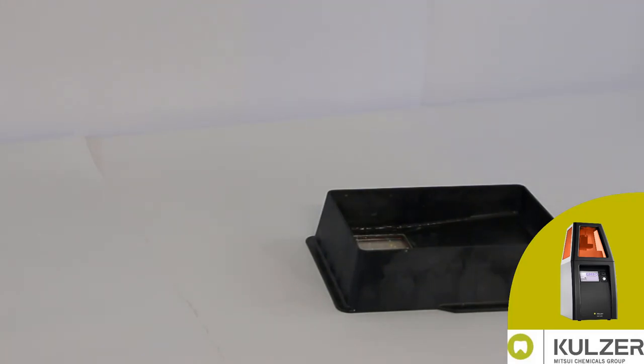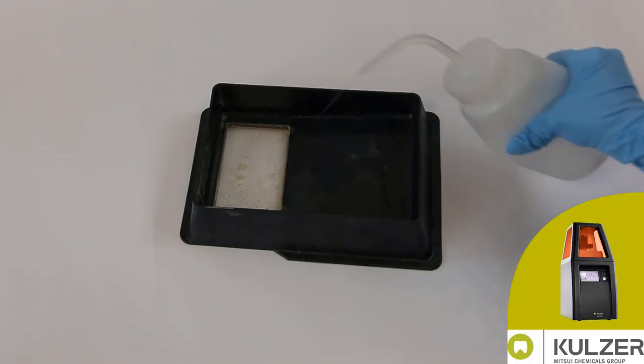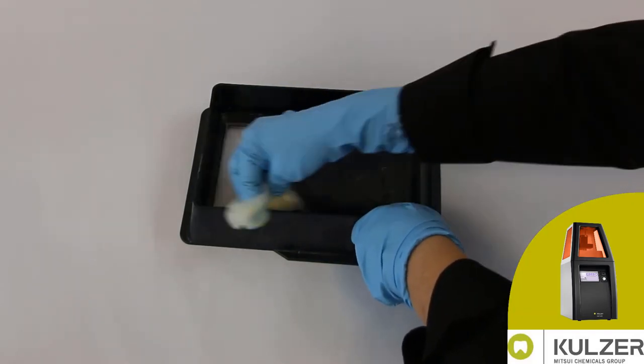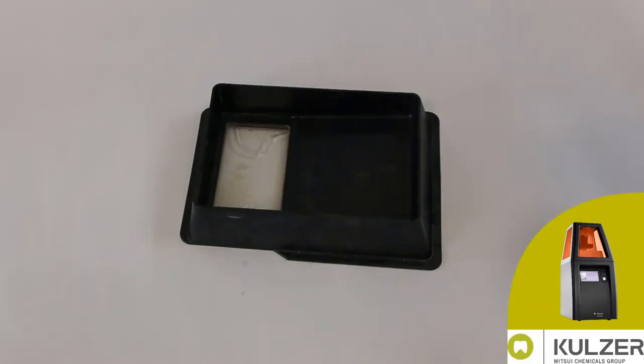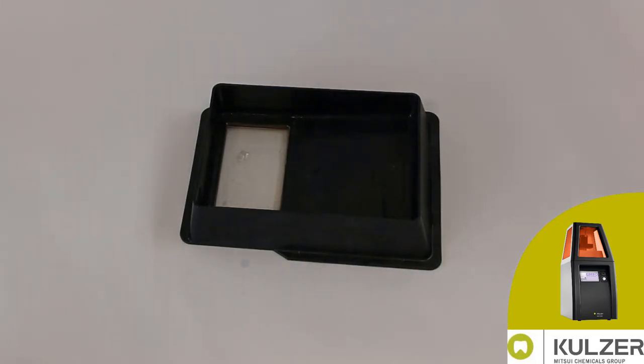Now add some isopropanol to the resin tray and let it act for a short time. Then remove the coarse residue from the black area.